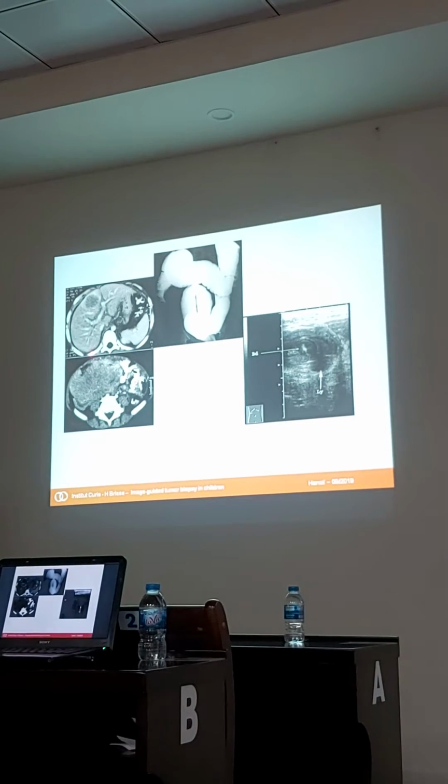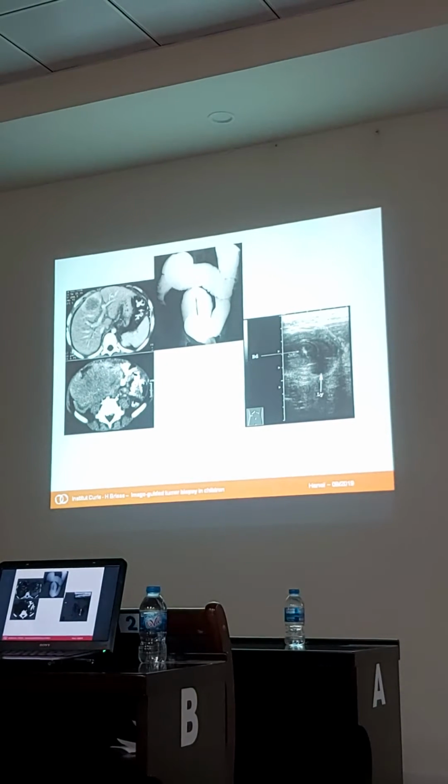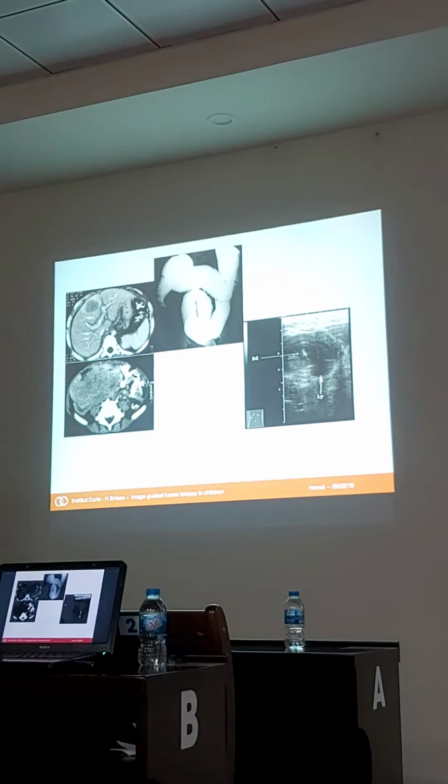So you can go directly anteriorly, just make a fine needle aspiration. In a few hours you can get the diagnosis, you begin the chemotherapy, and the day after the patient has no more bowel obstruction.